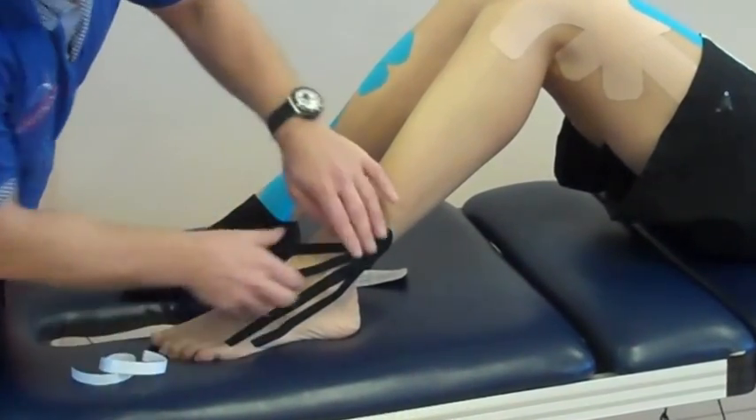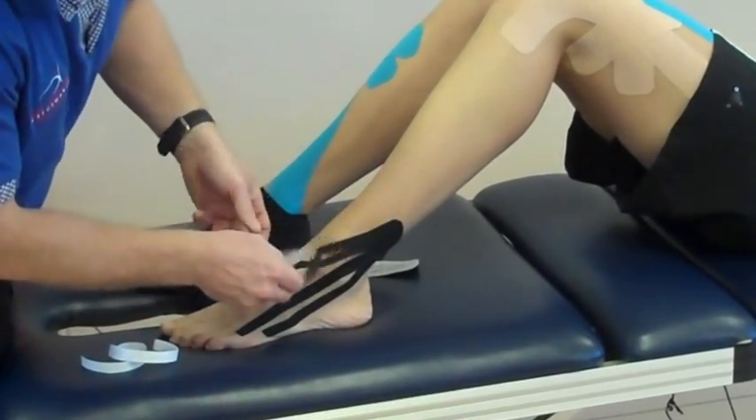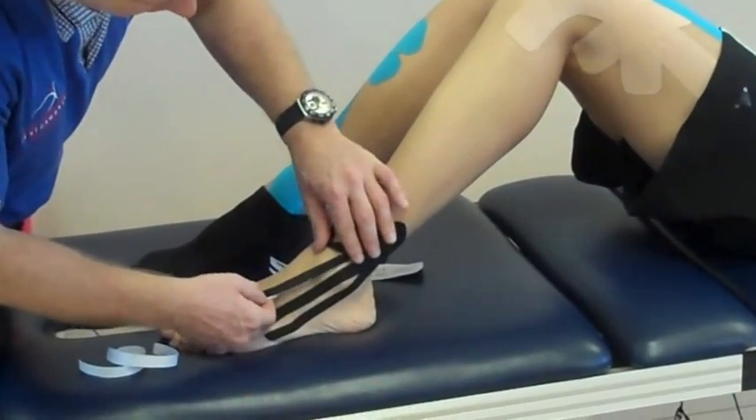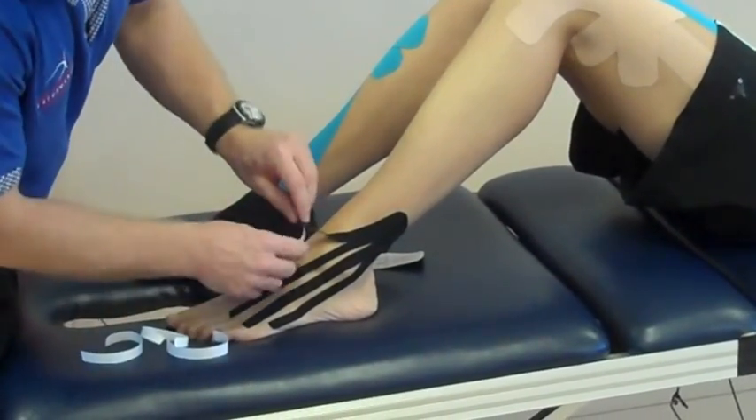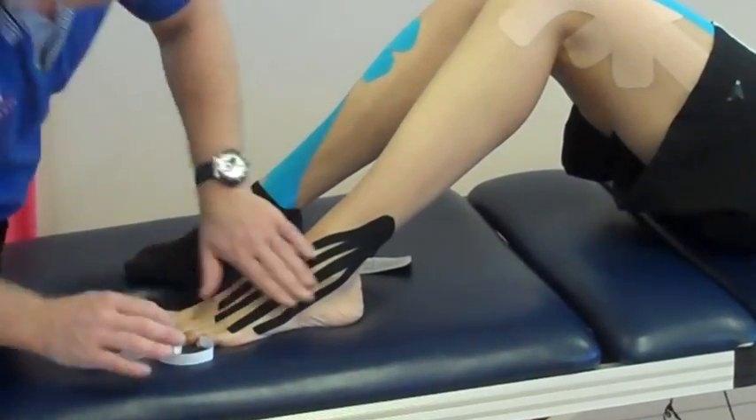And the third one, which comes off of the fourth as well. And then the last one, come across, so there's little to no stretch on there.